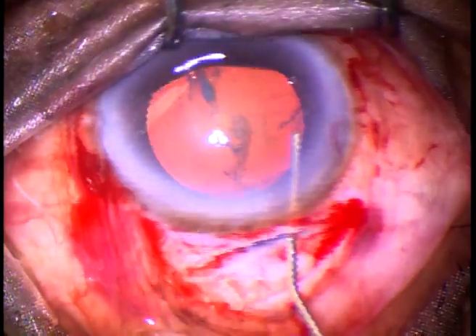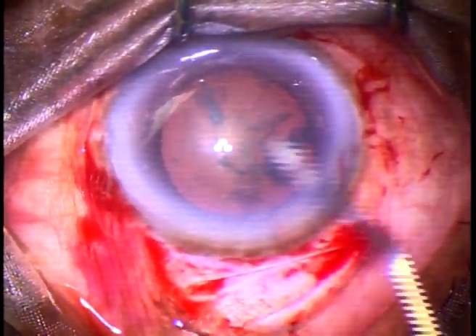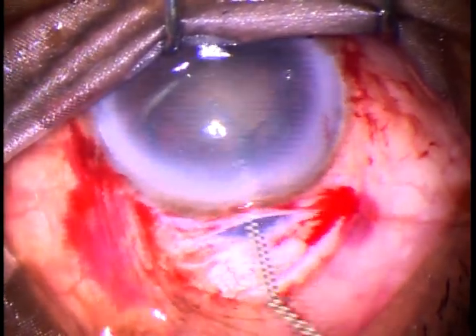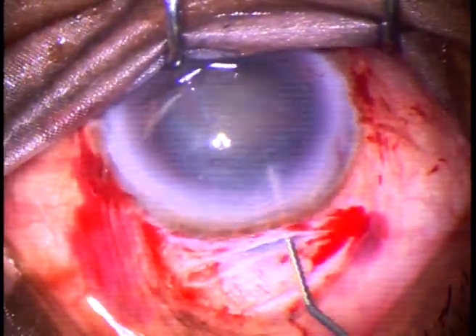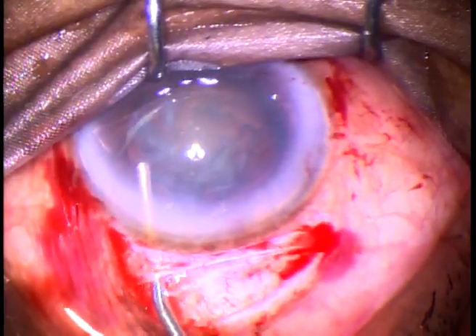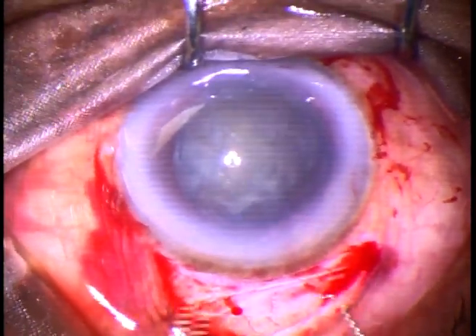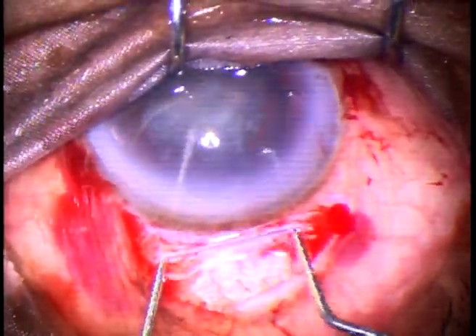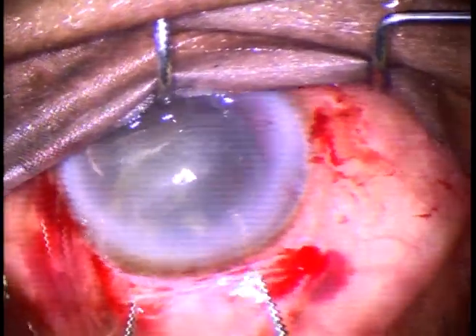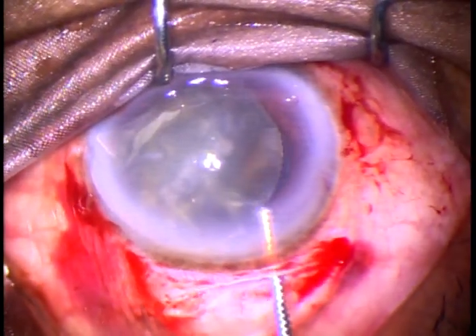Hydrodissection is being done. My plan was to prolapse the nucleus by hydro itself, and it happens in many instances. But in this case, just by hydro, it didn't prolapse into the anterior chamber. So, I inject visco, take two Sinski hooks, and bimanually rotate the nucleus. One instrument is just behind the nucleus, the other instrument rotates, and thus it comes into the anterior chamber.